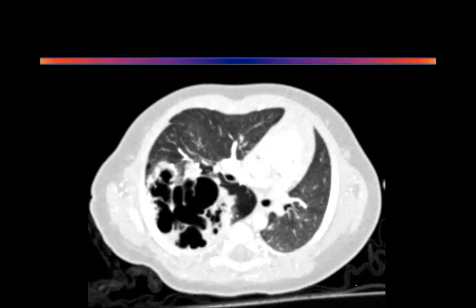I put up only one shot of the CT scan, and you have to talk about it. Or if I've got a screen with me, I will take you through the top to the bottom. Top to bottom is easier to understand, but the one thing you must not do in the exam is keep fiddling with the mouse. Don't keep going up, down, up, down. That really irritates the examiner. Look at it, let it go from top to the bottom, bottom to the top, and stop. Don't fiddle with the mouse. And then please stop at the most relevant shot of the pathology and start describing the pathology.